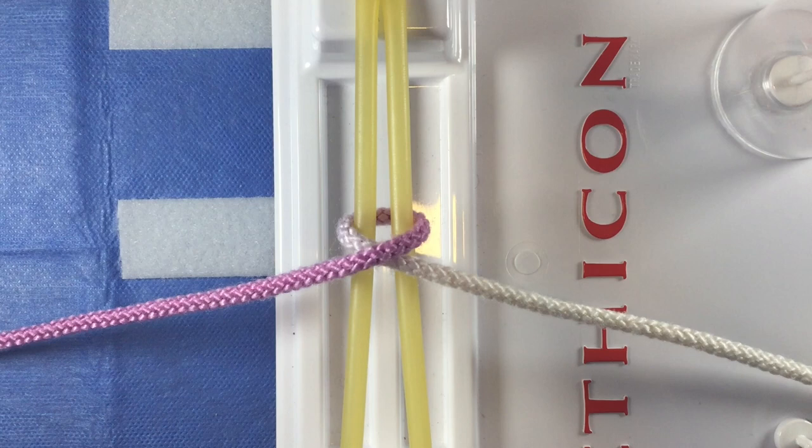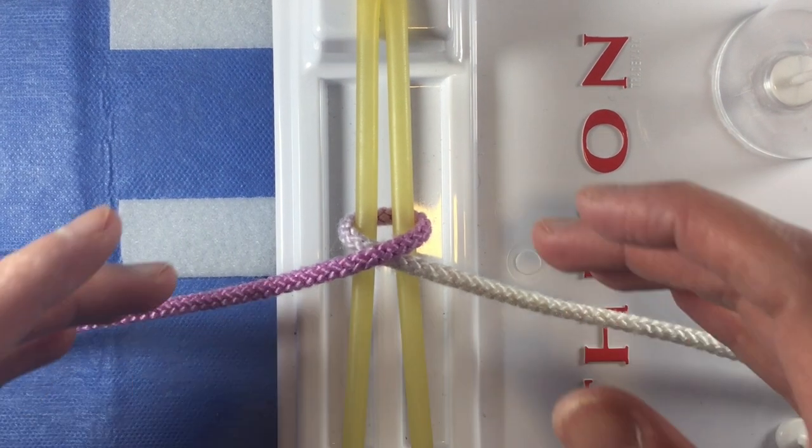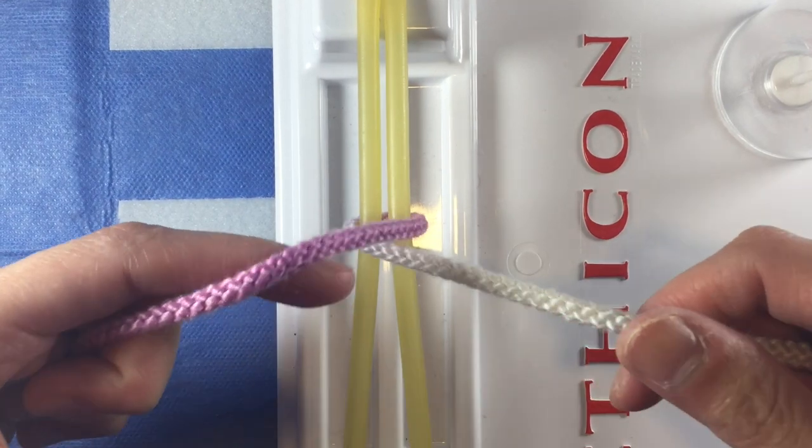Sometimes when performing a two-handed knot, the first throw will loosen when you let up on the tension in order to perform your second throw. One way to prevent this is to perform a surgeon's knot.